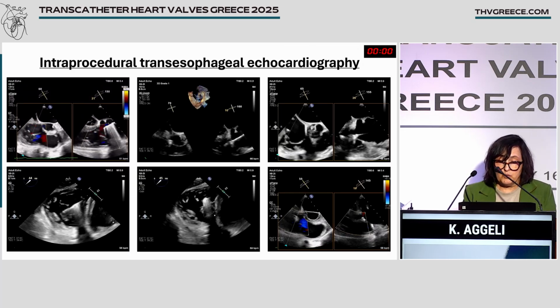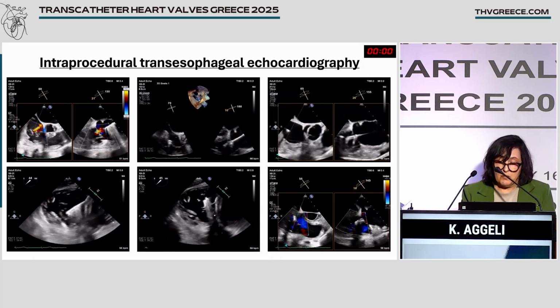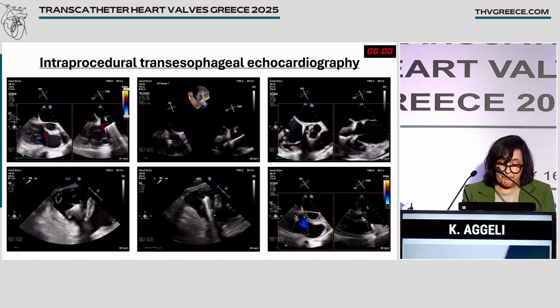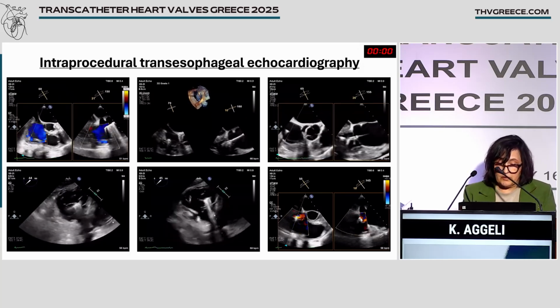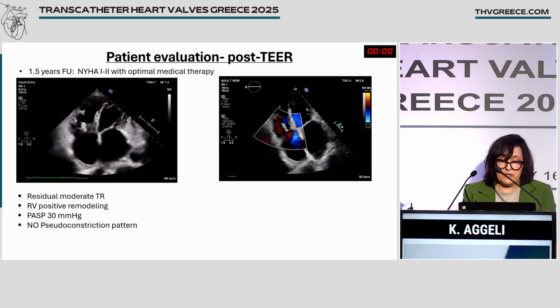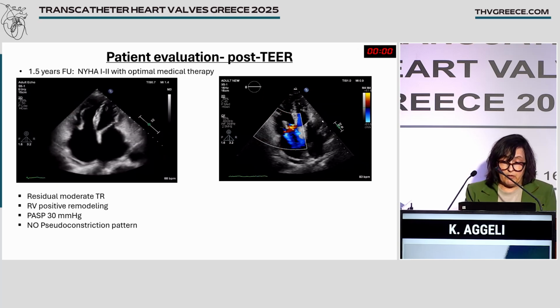And we proceeded to the TEER technique with one device implantation at the septal and anterior leaflet. And this is the pre- and post-procedure evaluation.